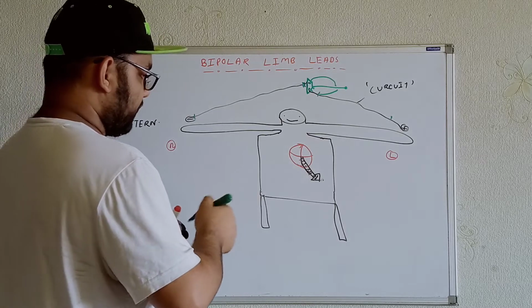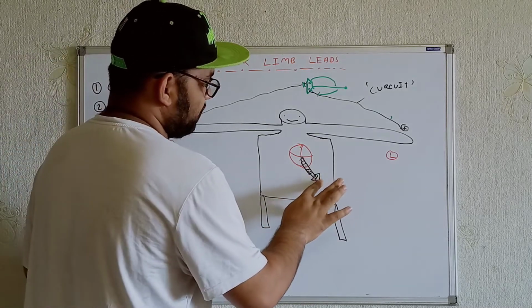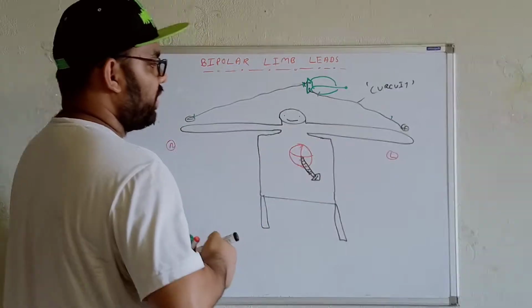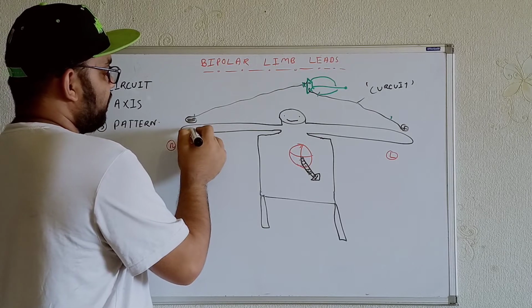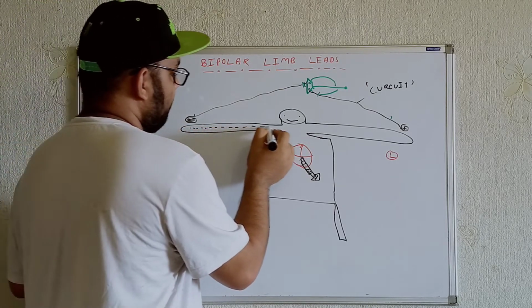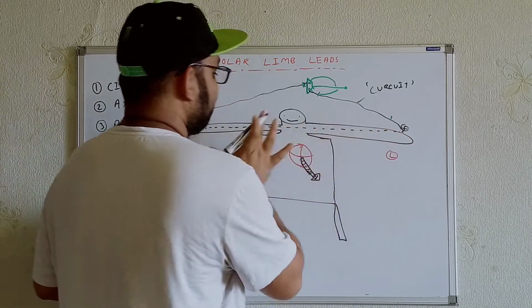Now from here, try to understand this. Let me show over here. We know the electrical vector from the major ventricular depolarization is in these directions. It will go left and downward. Now if I consider a line from the minus to the positive electrode over here, I am getting a line.